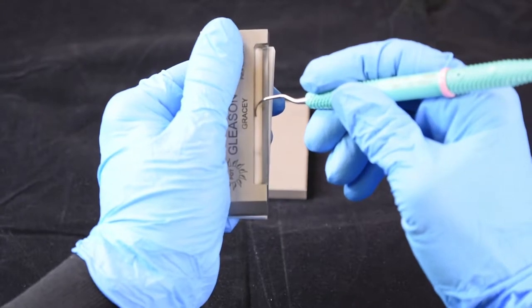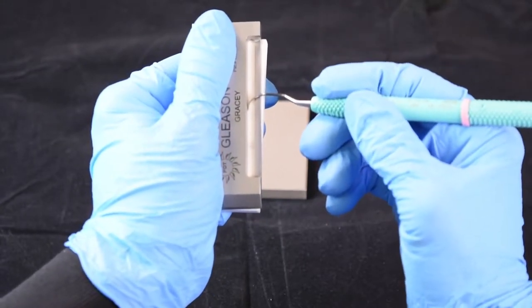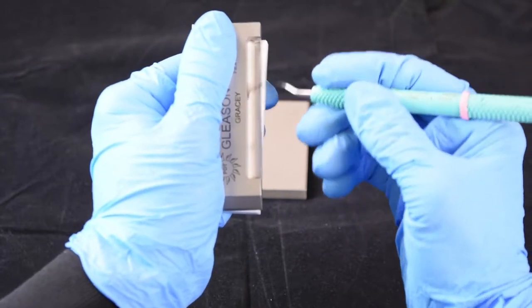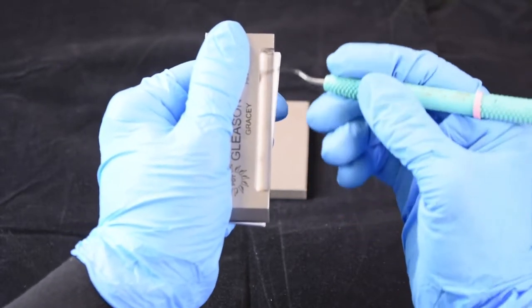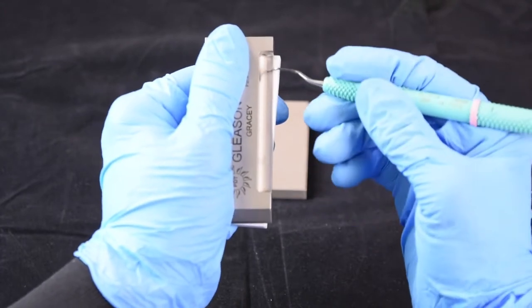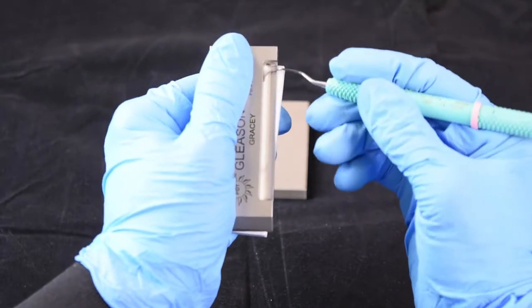Place the back of the blade against the stop, bring the terminal shank down to the rest, and glide. Using a pendulum motion, we have heel, toe, heel, toe.